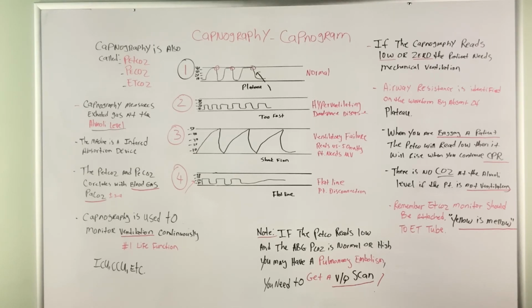The ETCO2 monitor should be attached to the ET tube. And you should always remember that yellow is mellow. We all remember that in seminars and in school.